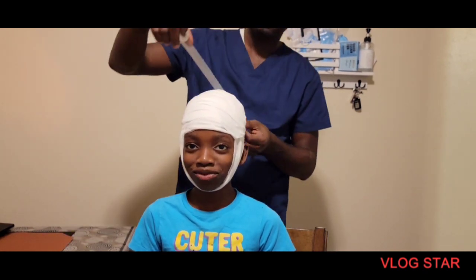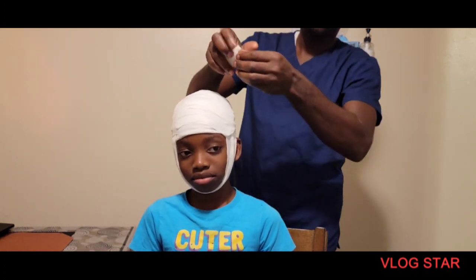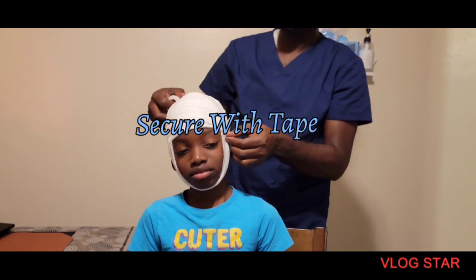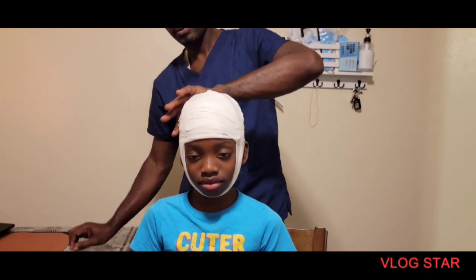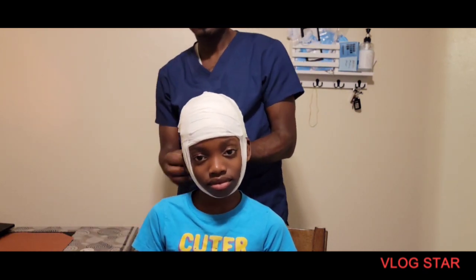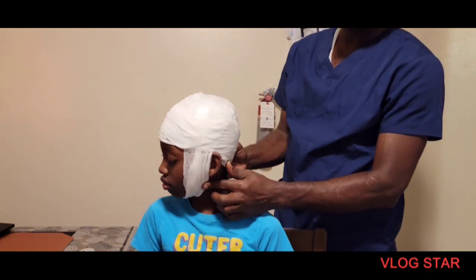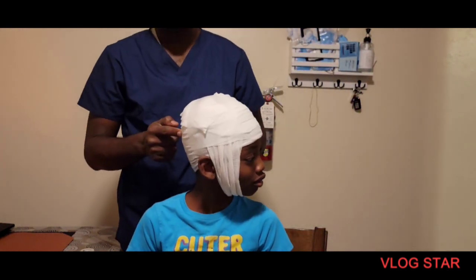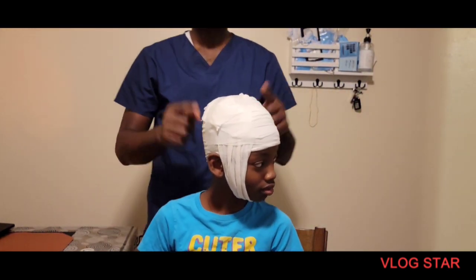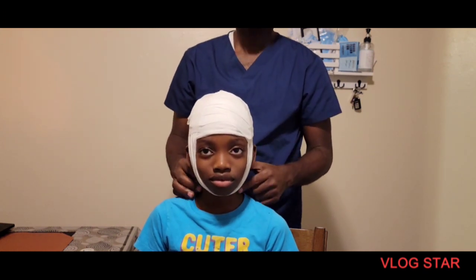All right, then I'm going to use more tape to secure it so it will stay in one place. Turn your head one last time. So there you go — that's all you do for the wrap for the EEG.